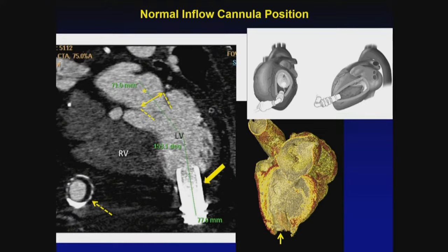So what is a normal inflow cannula position? I'm sure Dr. Kassi still has nightmares from when she was a fellow trying to measure this. It was a major issue, I think, correct me, with HeartMate 2. I think with HeartMate 3, it's become less of an issue. For the last several years, we might have seen one or two cannula malpositions of HeartMate 3, but still we need to pay attention.